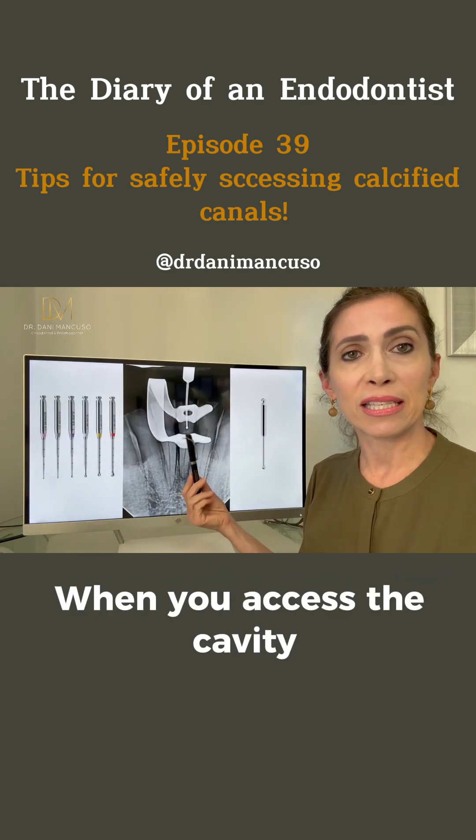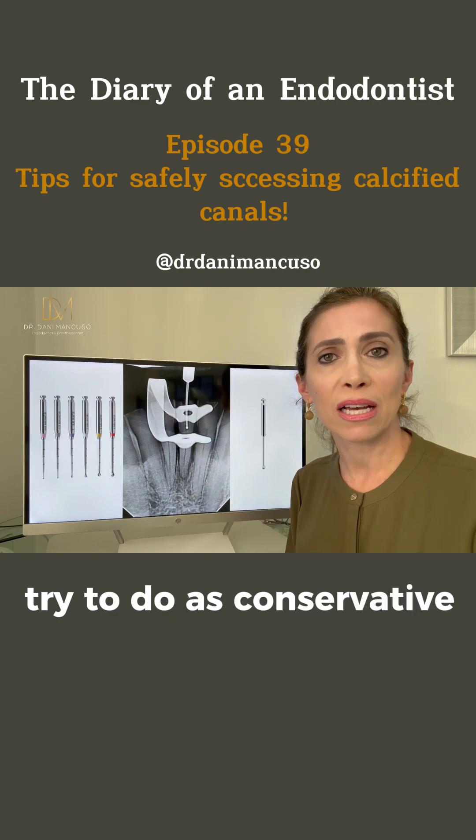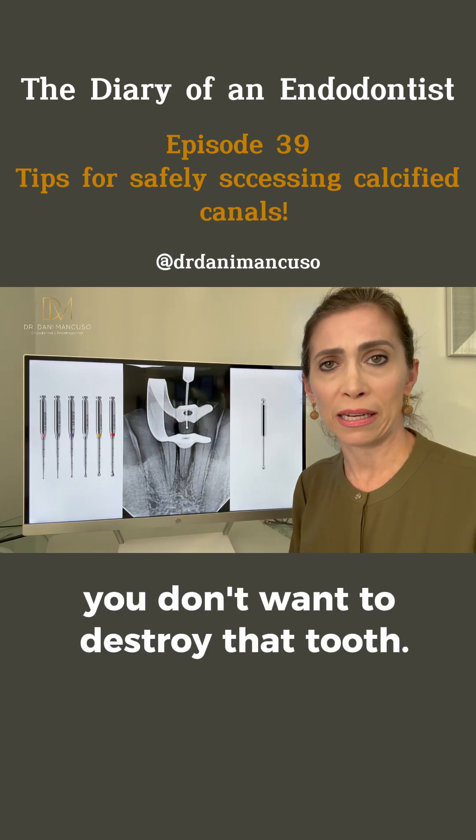So when you access the cavity, try to be as conservative as possible. You don't want to destroy that tooth.